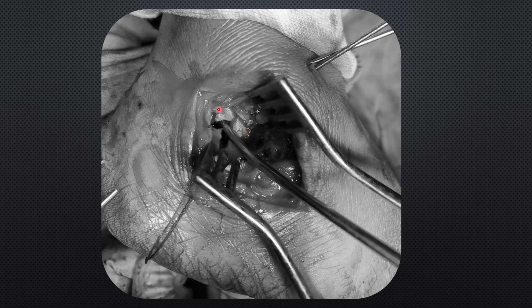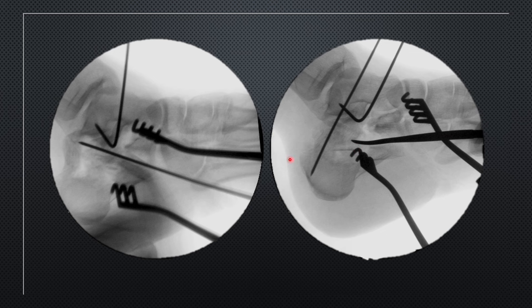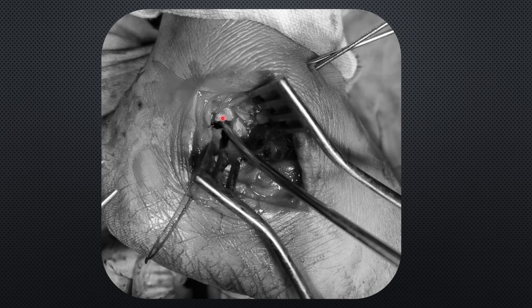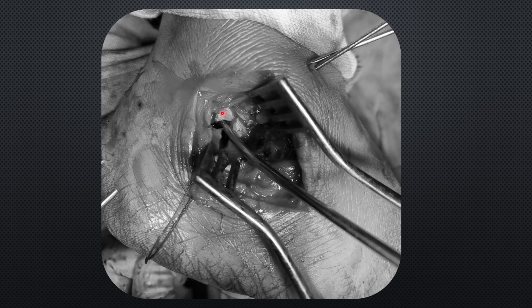This fragment is the displaced lateral one. Under direct vision you can pass a smooth instrument like a periosteum elevator. You see the periosteum elevator can lift this fragment towards the undersurface of the talus. While doing that you have to ensure that this fragment is also in line with the remaining part of the posterior facet — the plane of the remaining and displaced fragments should match as much as possible. Once that is done, you can pass an additional k-wire through the skin, then through the talus, and towards this fragment to secure it. Using the periosteum elevator you can give counter-pressure while placing the k-wire, otherwise the k-wire pressure can displace the fragment.